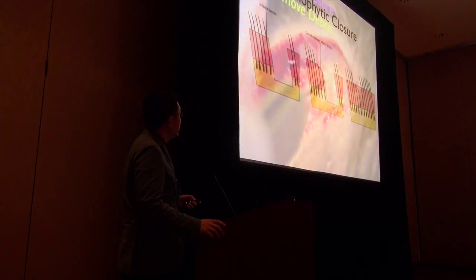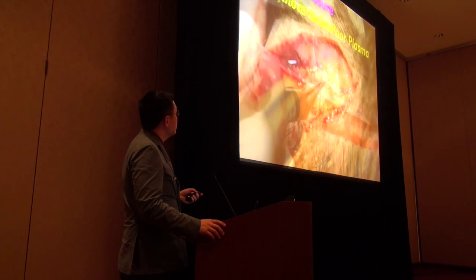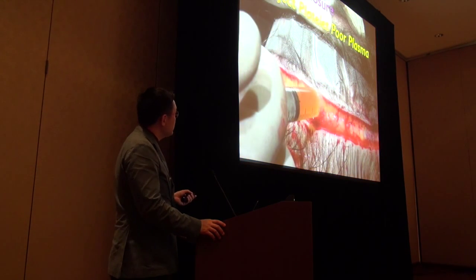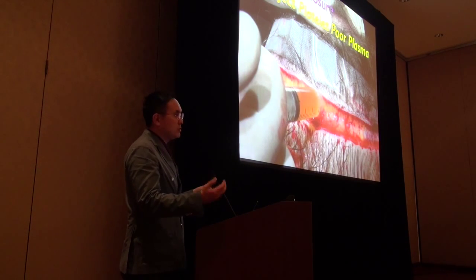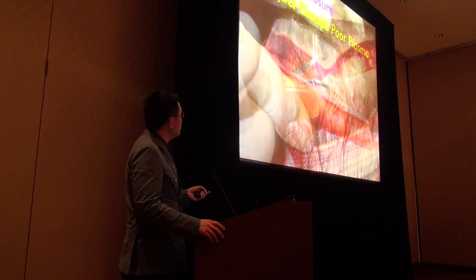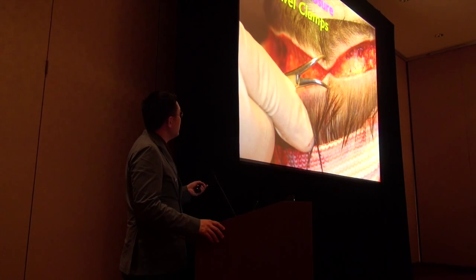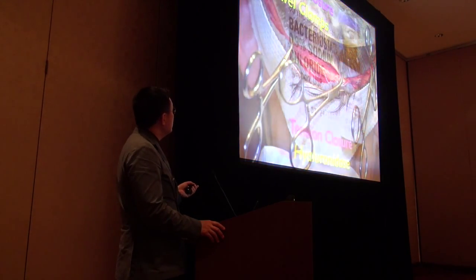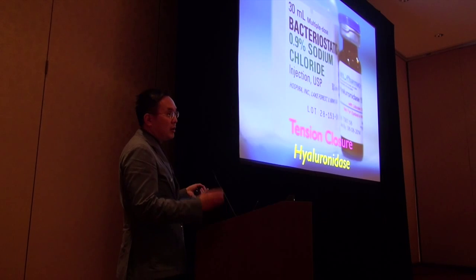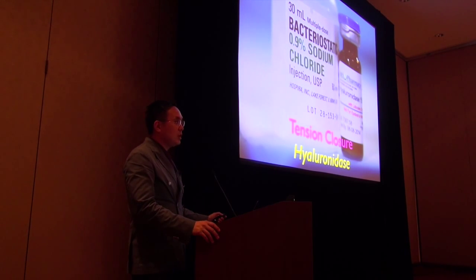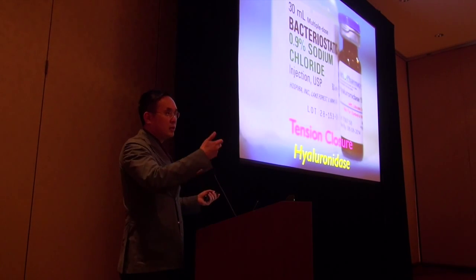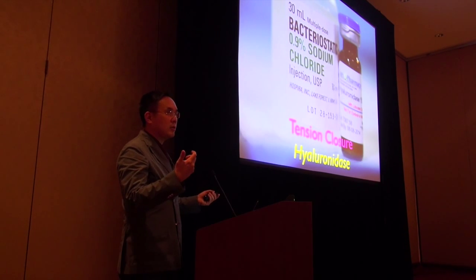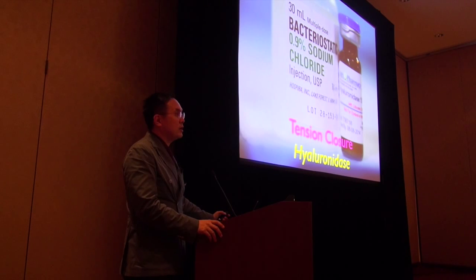Remove some debris so you don't have foreign bodies in there. Spray it down, clean it. I use platelet-poor plasma — I have a lot of it and the activity level is almost 80-some percent, so I spray some in and inject it after it's closed. Then I put tension clamps on to help align and decrease tumescent fluid. If anything is too much tension, just wait. I use hyaluronidase — only if there's too much tension — it really reduces tension a lot. I'll take a whole bottle, mix it in 5 cc's, inject it into the wound bed above and below about a centimeter, and it diminishes wound tension very quickly over about 10 minutes.